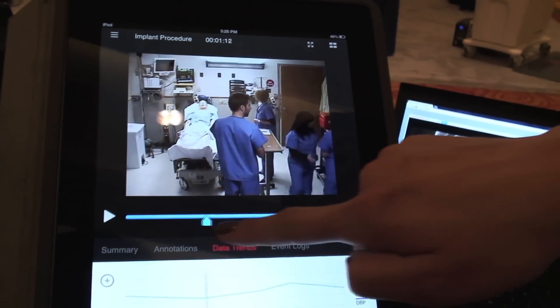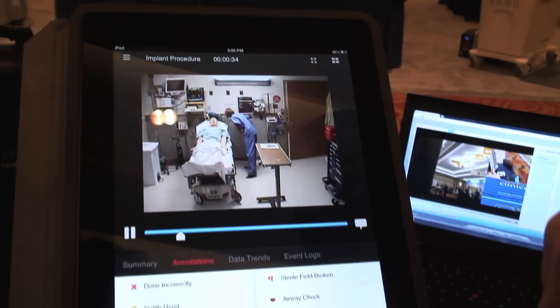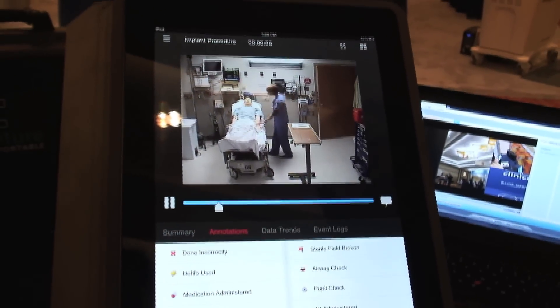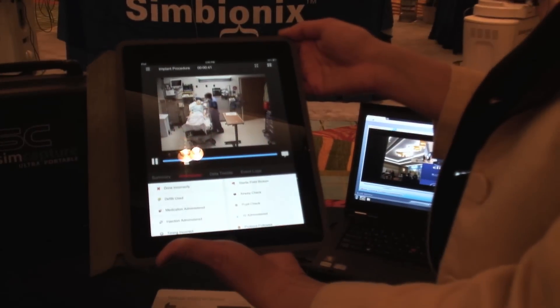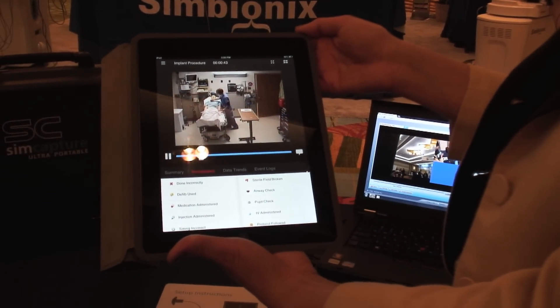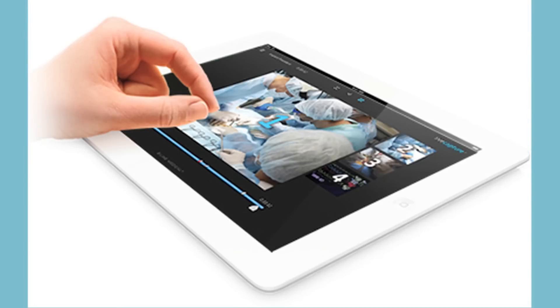You can also scrub to different parts in the video. You'll be able to see your annotations, which is fantastic. So in case we were in-situ and did not have the opportunity to have a debrief room quickly on a last-minute simulation drill, we could start to debrief in that particular setting with a small number of people who could all gather around an iPad.